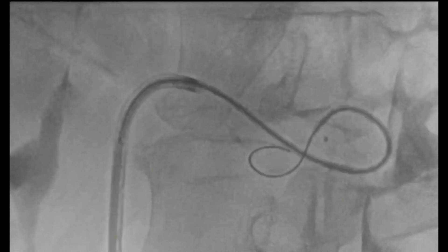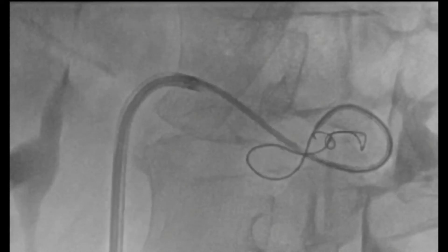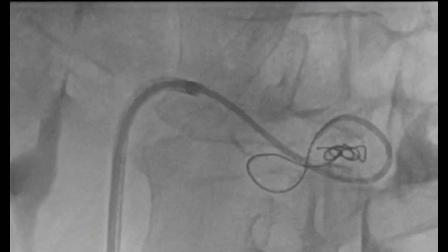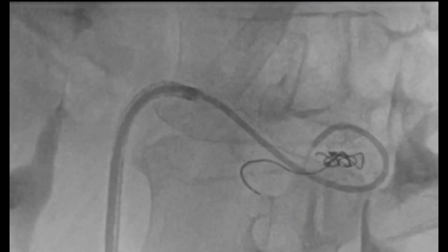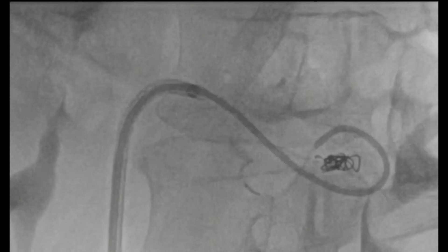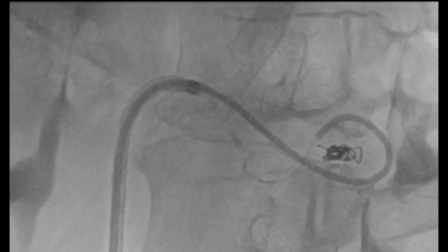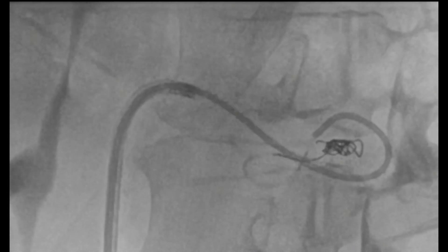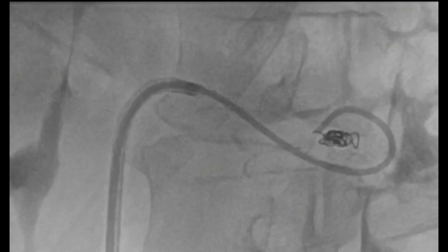This is followed by introduction of a 5 by 15 mm detachable coil in this lower renal pole branch to perform coil embolization and prevent endoleak after successful repair of the renal artery aneurysm.